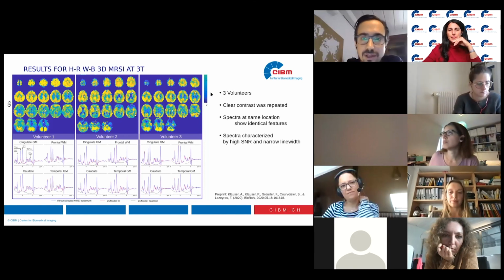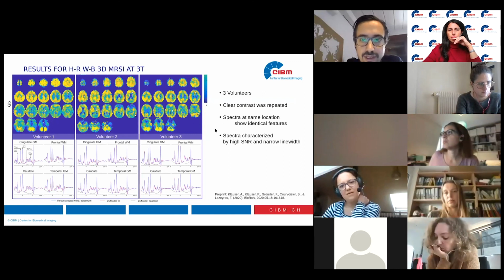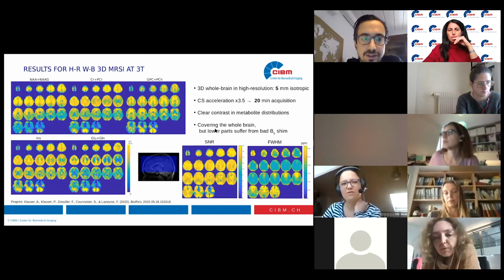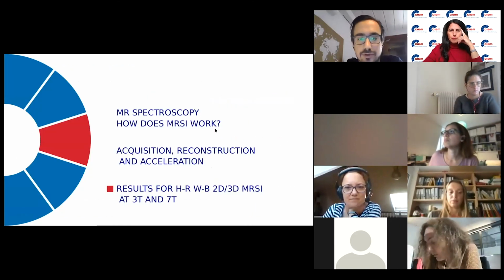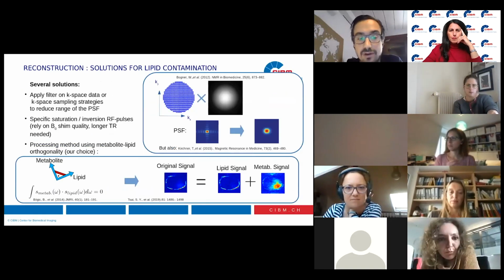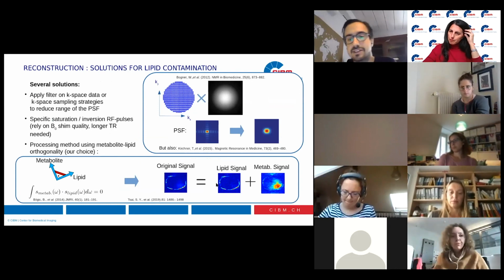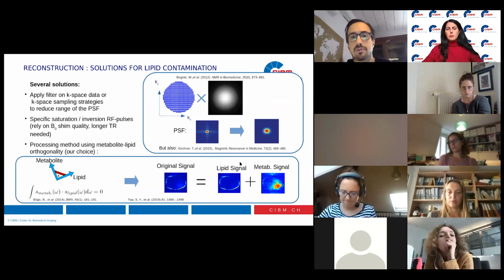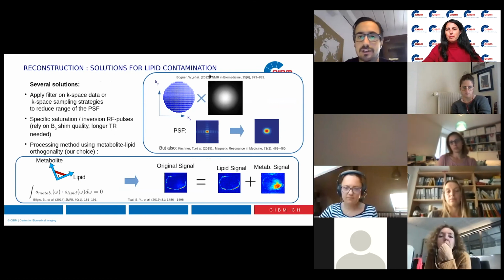So basically, when you do the splitting, I go back to the method where I show that using the orthogonality, the macromolecules are not orthogonal to lipid signal. They're actually parallel to lipid signal. So they would be identified as lipid signal, and they are removed from the spectrum. So in this case I'm quite sure that it cannot be used to measure macromolecules.